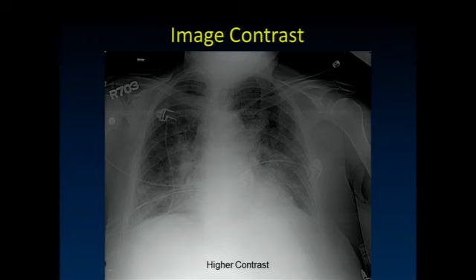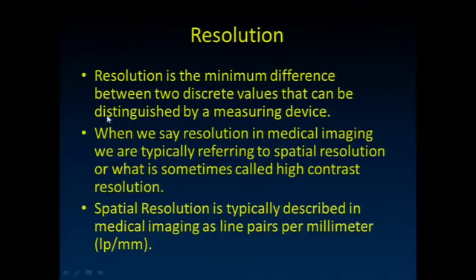If you ever have an image and you can't see a particular area well, ask your tech to go back and reprocess it, and they'll adjust the K. Let them know the part of the image that you want to see the best, and they'll choose a K that gives you better contrast in that region, okay? The only downside is the image might get quite noisy in that region.